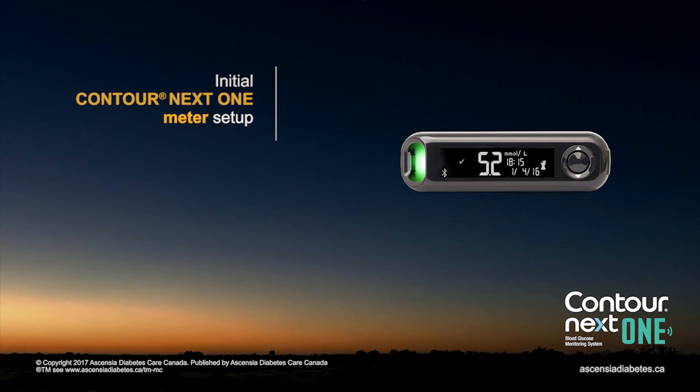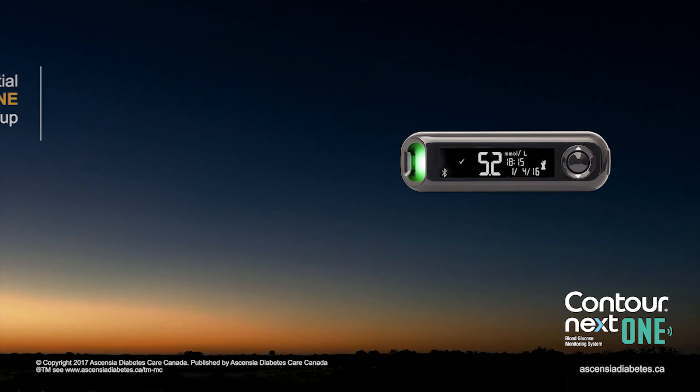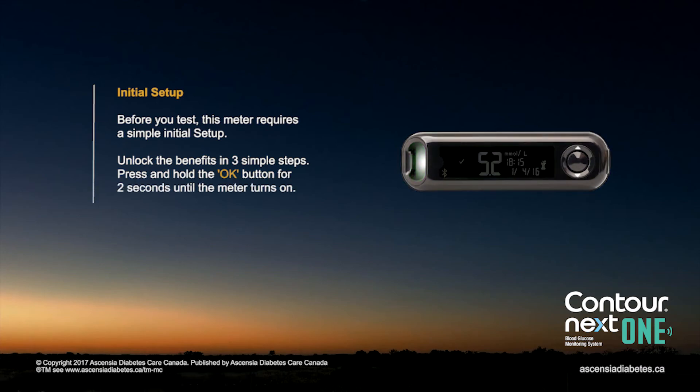Initial Contournext One Meter Setup. Before you test, this meter requires a simple initial setup.